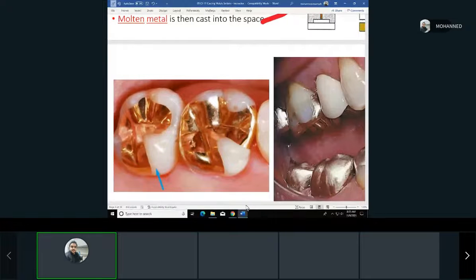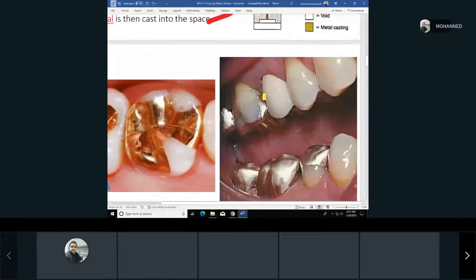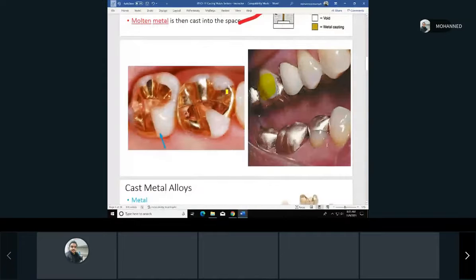We have some of these also, what we call 3/4 crowns, which will cover all of the tooth except the buccal part of the tooth. You see the buccal part is still remaining the same. It's only the other parts. These are not done much nowadays, but again, it's kind of part of the onlay thing.